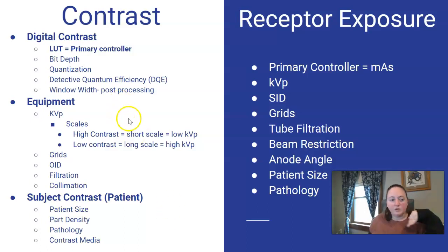Okay, so these really took us through contrast and receptor exposure, parts of the imaging chart on the specs, and just remember contrast is still on there even though it's out of the chart.